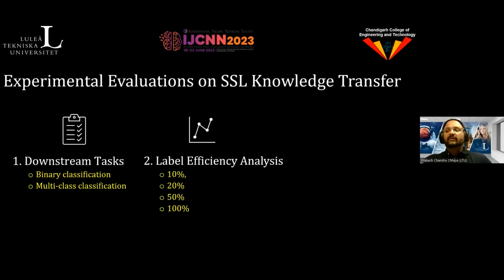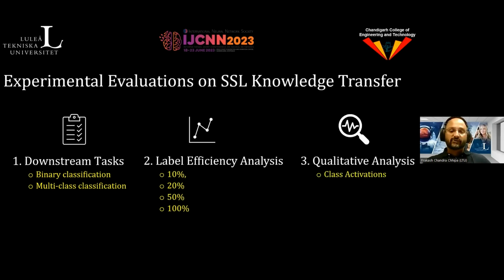Secondly, since self-supervised learning claims to learn effective representation, which can cut down the requirement of label examples in the downstream task, during fine-tuning we might require fewer labels. We will see how well the model has learned the representation, so it can reduce this requirement, and how much it could be reduced.